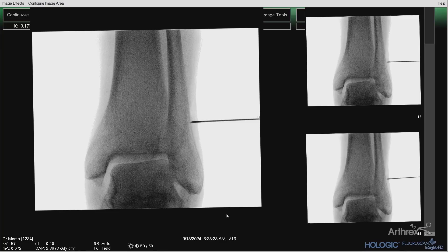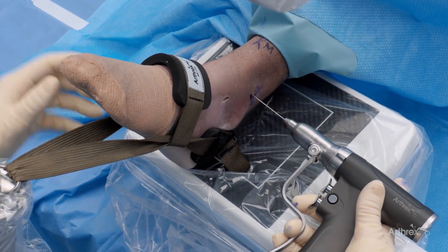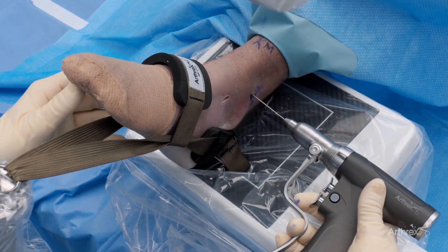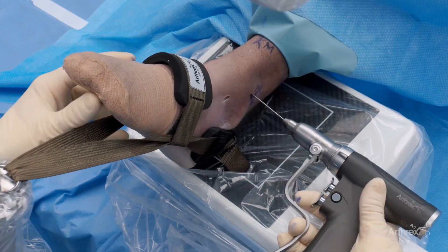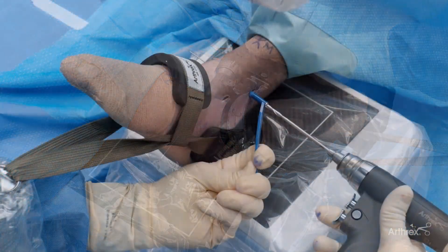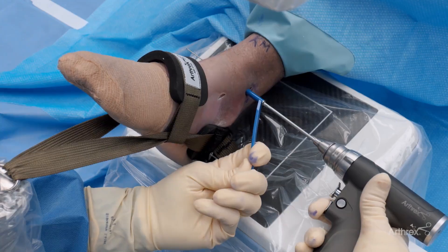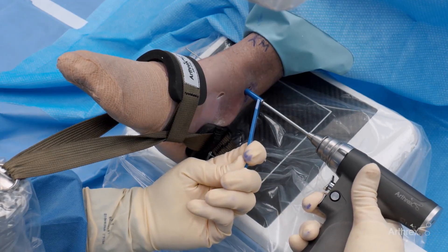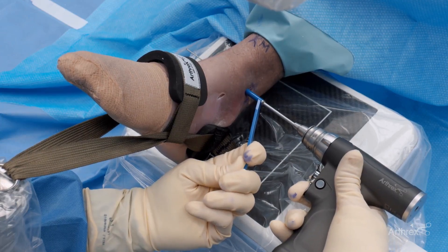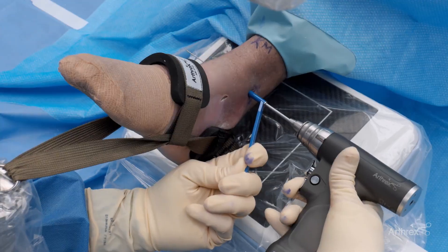Once diagnostic arthroscopy is complete, we use fluoroscopy to identify where the tightrope should be placed — proximal to the joint line but within the incisura. We place our guide wire and make a small percutaneous incision, which is how we get athletes back so much faster. Under fluoroscopic guidance, we take our Arthrex Synergy system and drive the wire across the syndesmosis, dropping the hand approximately 30 degrees to get the proper angle. We then use the Synergy Power System to drill across the syndesmosis, following the guide wire nicely across four cortices. Make sure to feel that nice pop along the medial cortex, but not plunge through the periosteum — keep the periosteum intact to act as a trampoline to stop the tightrope button.